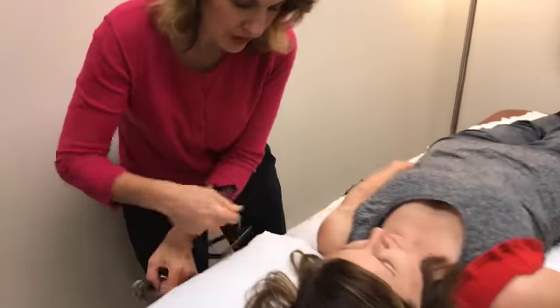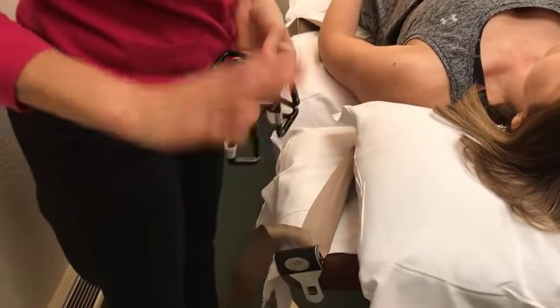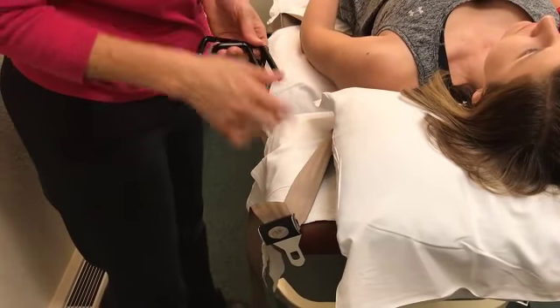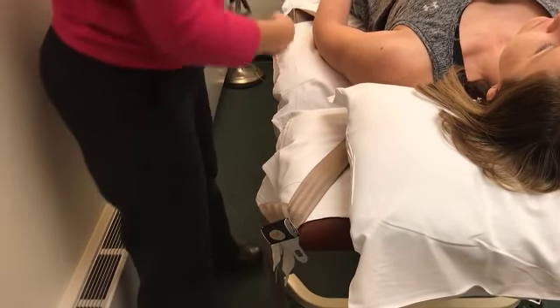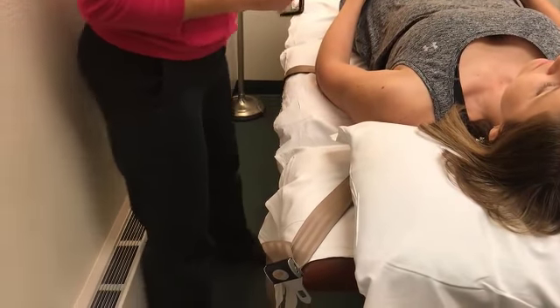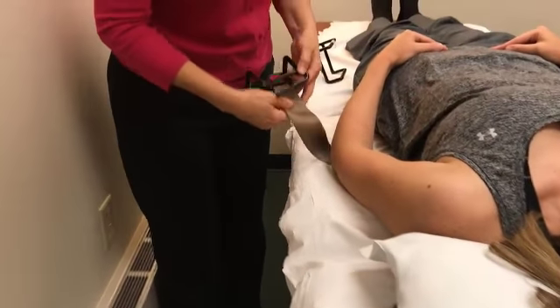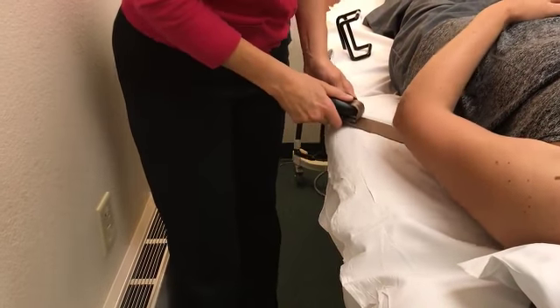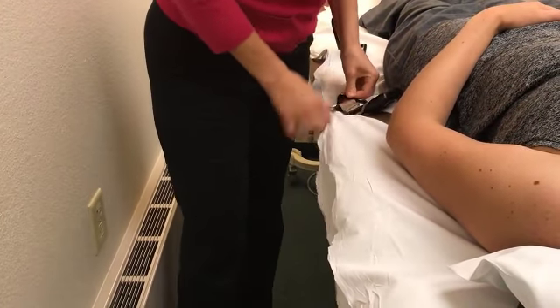And then I'm going to use the clips. These are clips that you can buy commercially, or you can just go to a hardware store and get the plastic clamps. They work just as well. When you're applying the stabilization for the ends, start with the buckle side first. So you come in, you go through fully the end, and then you come back on itself, and then you lock it into the corner so it's secure.